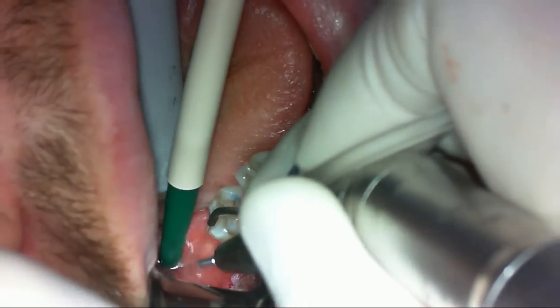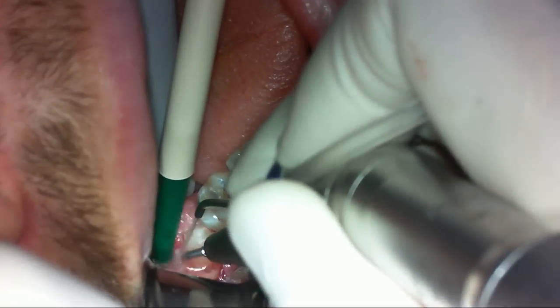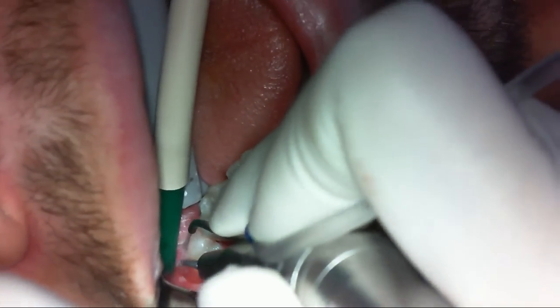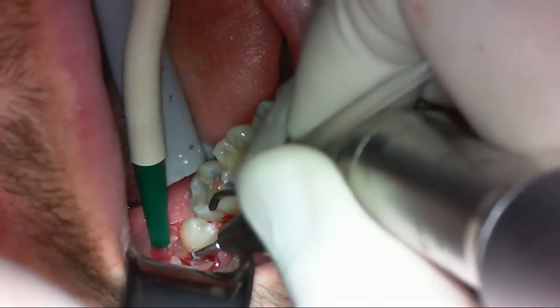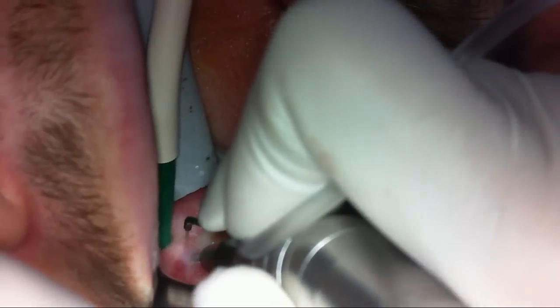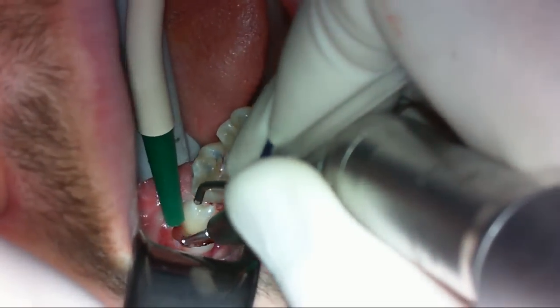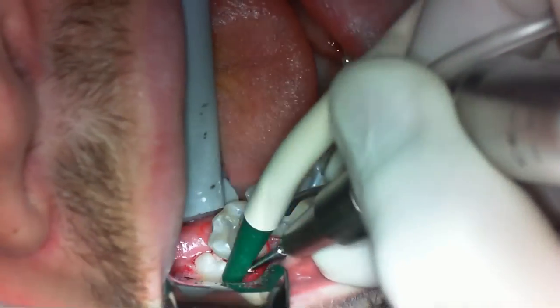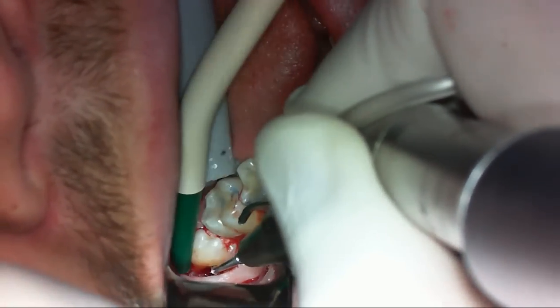On the mesial, try to expose the whole crown if you can. Now for the distal tunneling — I don't have to reflect any soft tissue there; I'm basically tunneling my bur under soft tissue from the depths of the buccal gutter. Your DA can use narrow suction to reflect some of the mucosa on the distal to make it easier. If your tunnel is not adequate or you haven't removed enough distal cortical plate, you risk breaking the distal root when elevating.